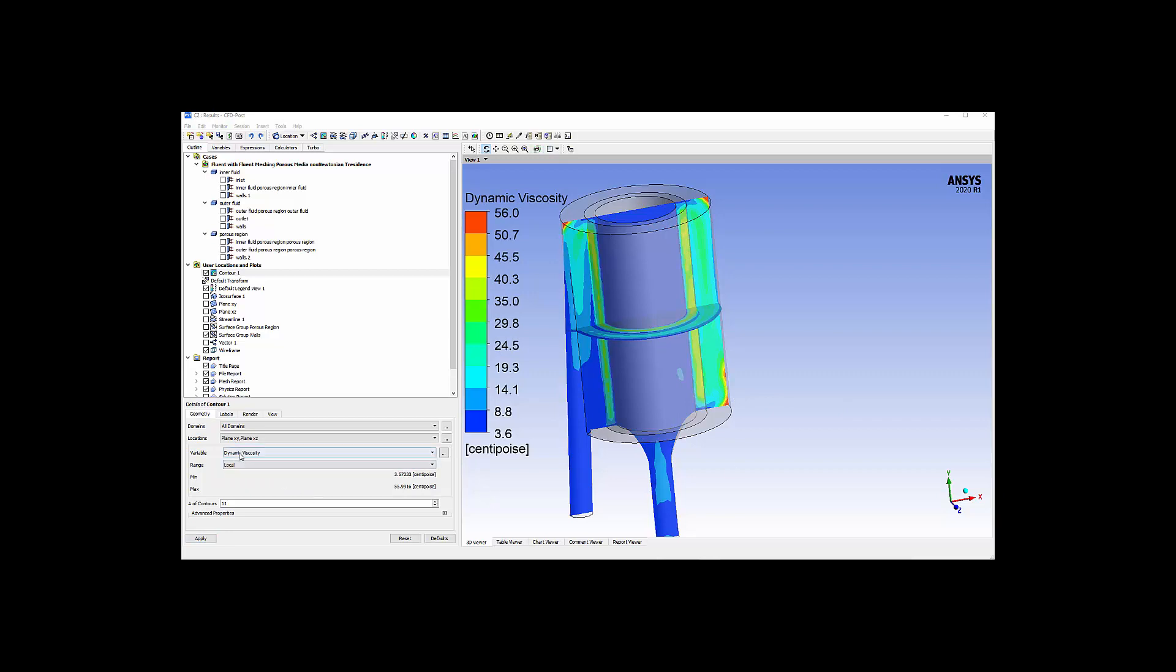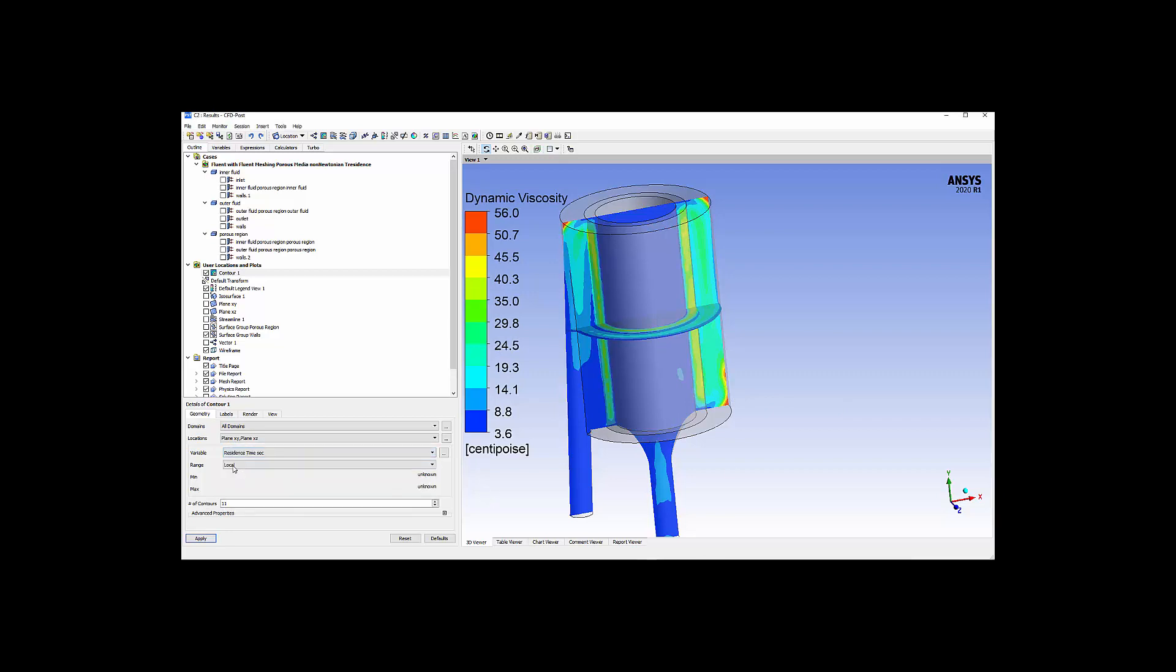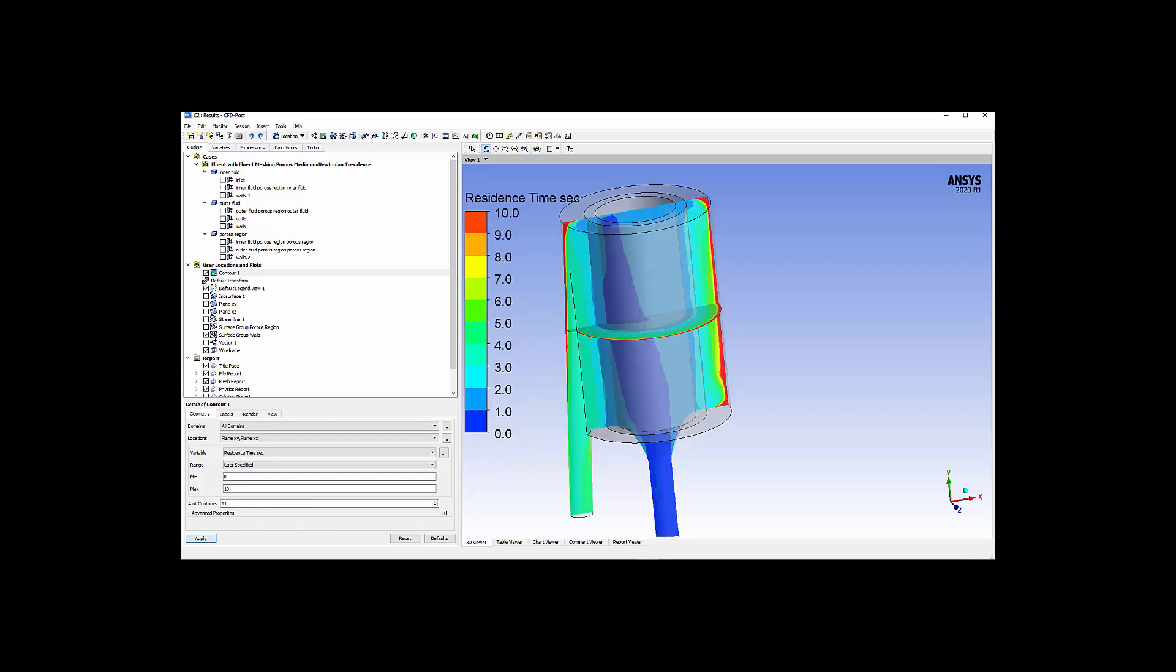Next, I'd like to look at residence time. I'm going to scale this between 0 and 10 seconds. Residence time indicates how long the blood has been within the filter. This is an important value as the longer the blood resides in the filter, the more likely a blood clot is to form. The highest values occur along the walls of the outer region. Here again, reducing the fluid volume in the outer case will significantly reduce the residence time values and improve the overall washout of the filter.